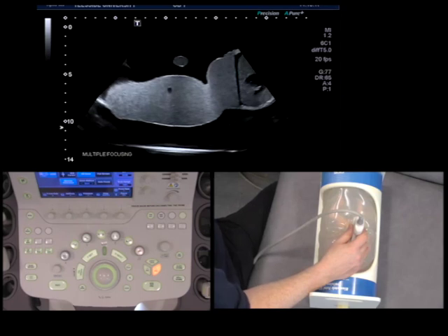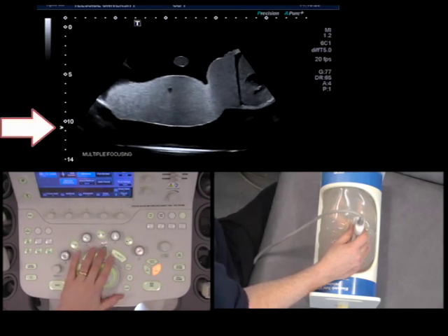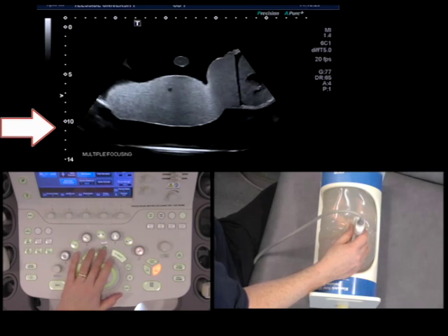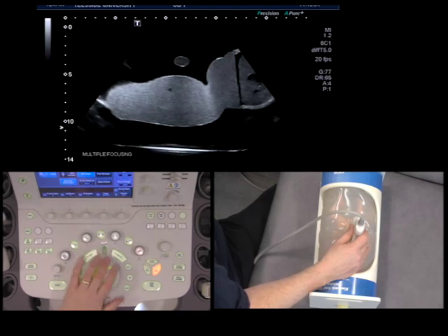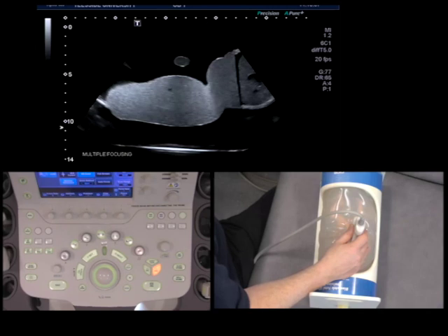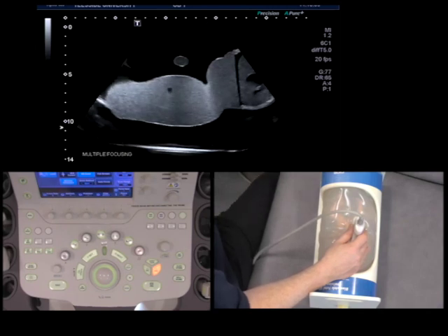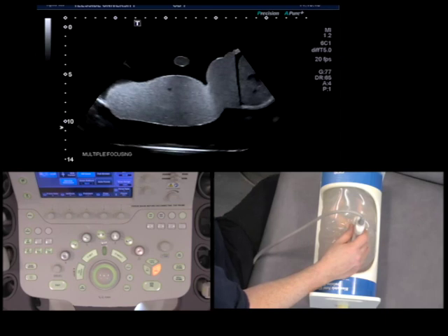We always want to have our focus in the right place, and you can see it on the screen as the little arrow there. Using this button here, I can move the arrow up and down. What this does is it improves the lateral resolution at the point that the focus is at. So you always want the focus at the area of interest — this is where it will give us the best lateral resolution.